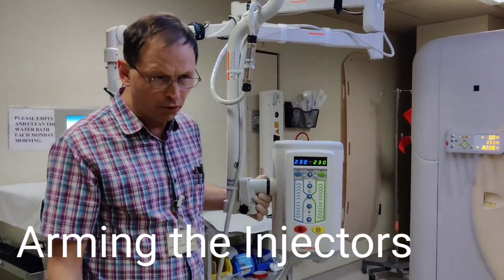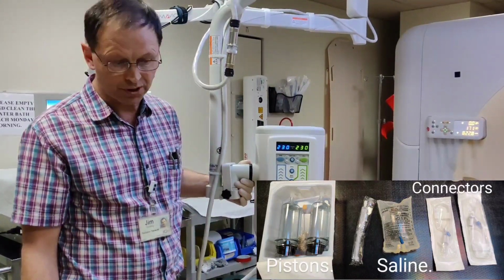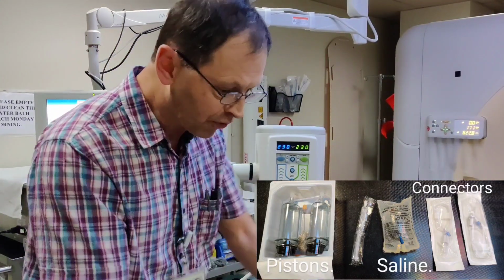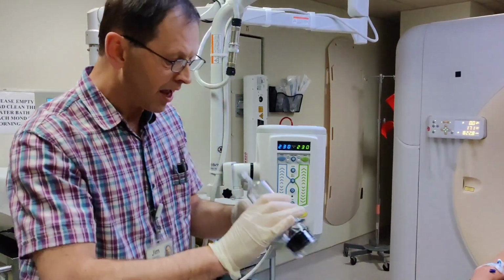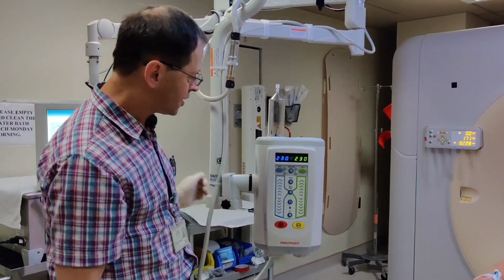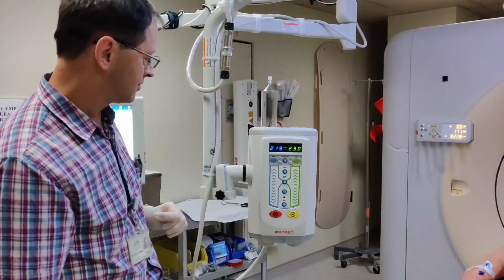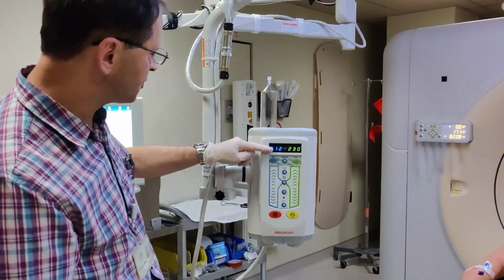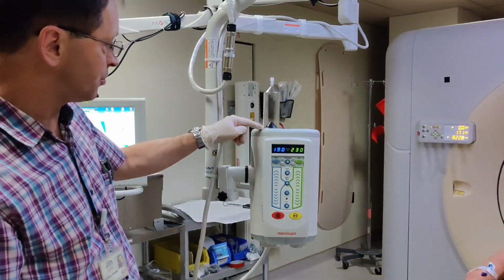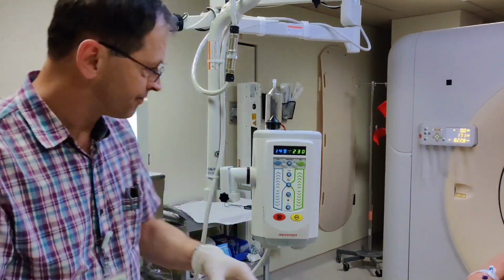So we've selected our protocol on the control unit outside the room in the console area. Now we're ready to load our syringes. So I'm going to grab the first of the syringes, and it's a simple snapping action to attach it. It just clicks. You should see the plunger start to engage. So you'll see the numbers go down, telling me the plunger's going to start to move. It'll push the plunger all the way to the end. So you need to load both syringes.